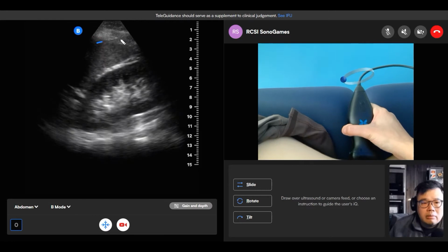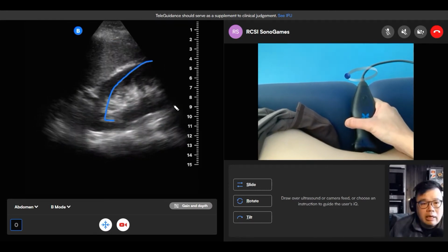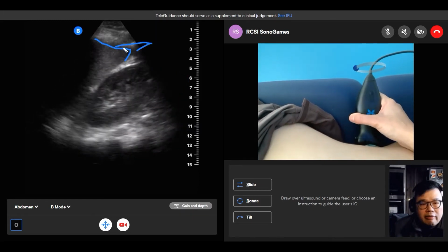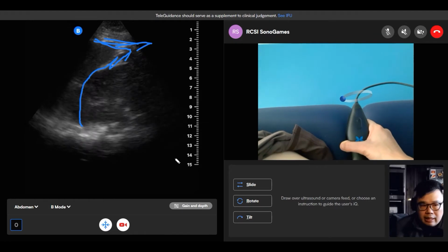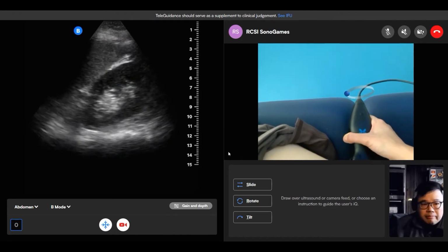Okay, so what's this structure? Spleen. Excellent. And this? Kidney. Perfect. So you got a bit of the diaphragm up there. There's diaphragm up there, and then there's the spleen, and the angle between the spleen and the kidney. Okay. Where do you think the fluid is going to appear, Katrina?